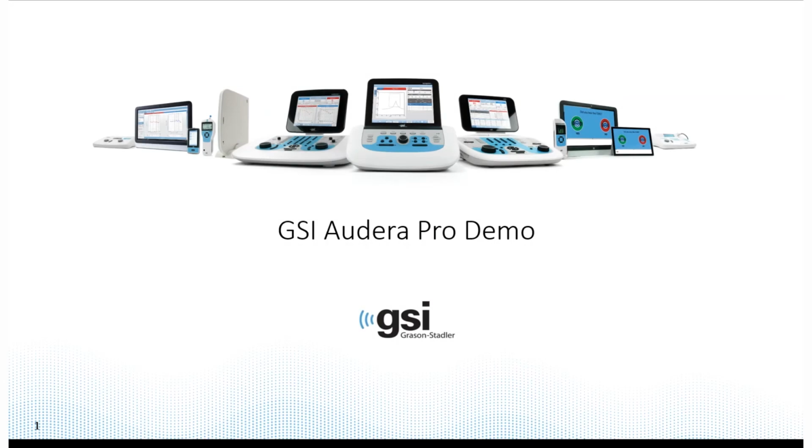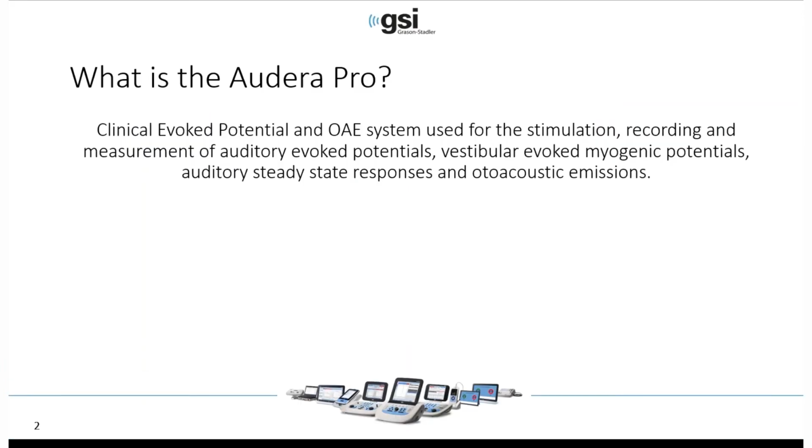This is a demonstration of the GSI Audera Pro. The Audera Pro is a clinical evoked potential and OAE system that can be used for the stimulation, recording, and measurement of auditory evoked potentials, vestibular myogenic potentials, auditory steady-state responses, and OAEs.